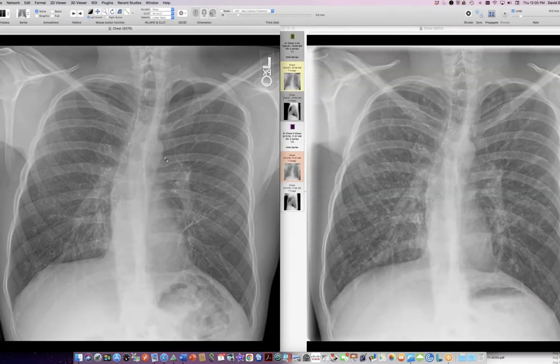Let me show you the way things looked a couple of years ago. This is a current radiograph from yesterday. And this radiograph is from 2019. You can see this person had all of these nodules all over the place in a bronchial distribution. And this is a patient with cystic fibrosis. So these are mucus plugs, and there are some thick bronchial walls here. You can see some rings and so forth. But most of these blobs are mucus plugs. Mucus plugging has really decreased quite a bit.